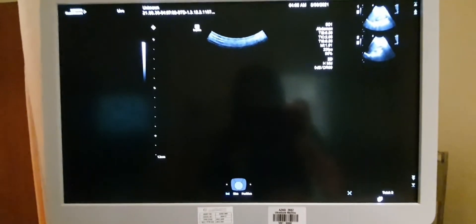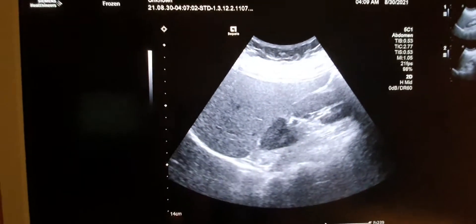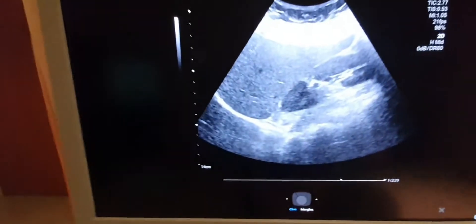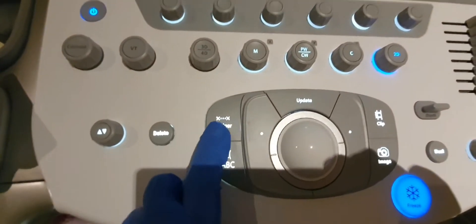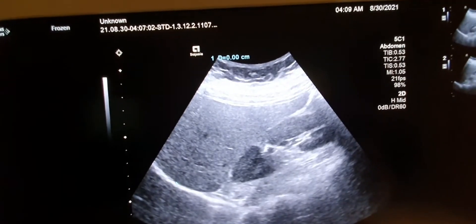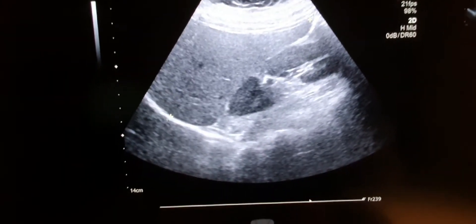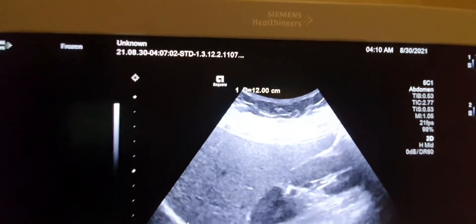Let me show you how to measure the liver properly. I'll scan my liver and take a photo. This is my liver — to measure it, press caliper, select distance, and measure from the right lobe to the left lobe. My liver size is 12 cm.